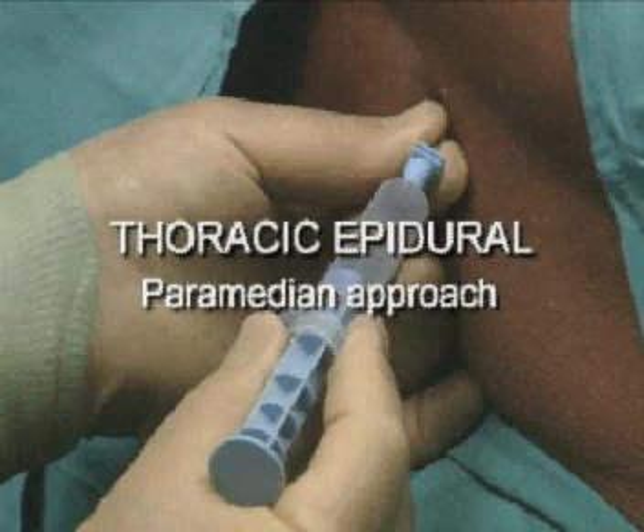This section shows the preparation and procedure required to perform a thoracic epidural using the paramedian approach.